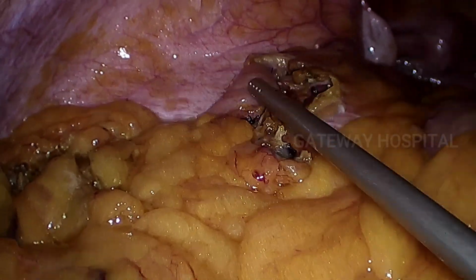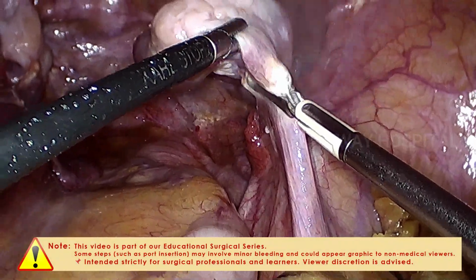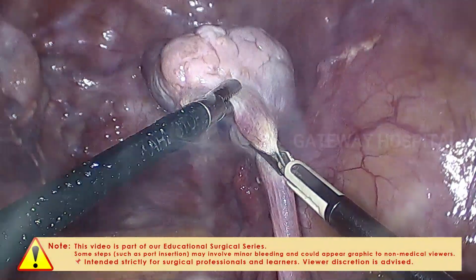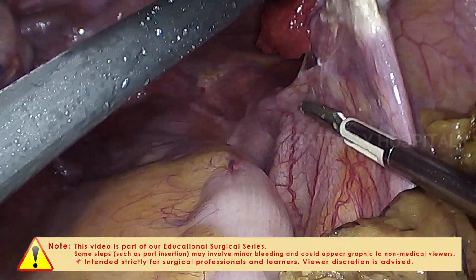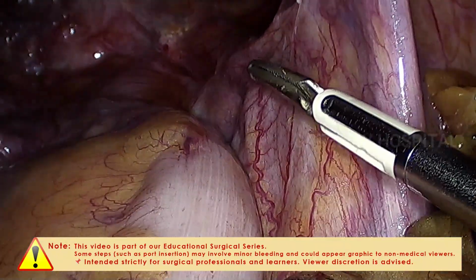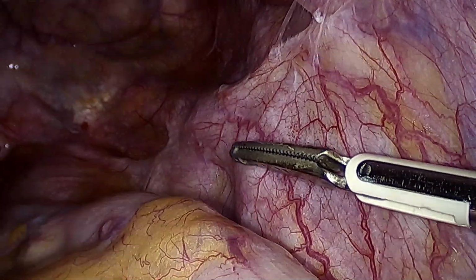This patient had undergone previous hysterectomy. The gynecologist has advised to remove the ovaries along with the tube on either side, and that's what we are trying to do. You can see the course of the ureter. The instrument is touching the course of the ureter, and you can appreciate the peristalsis.